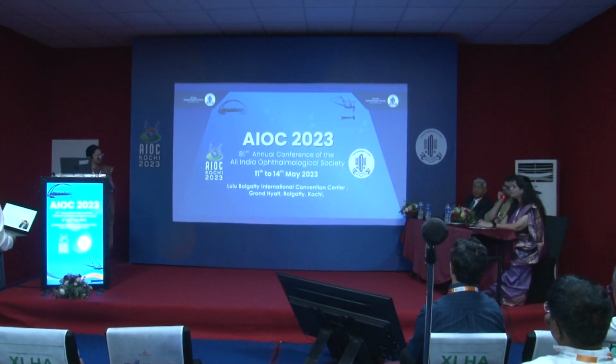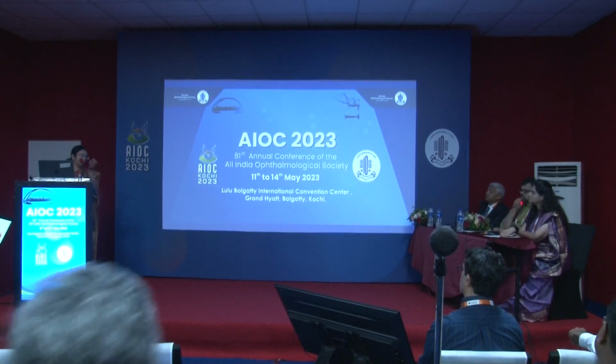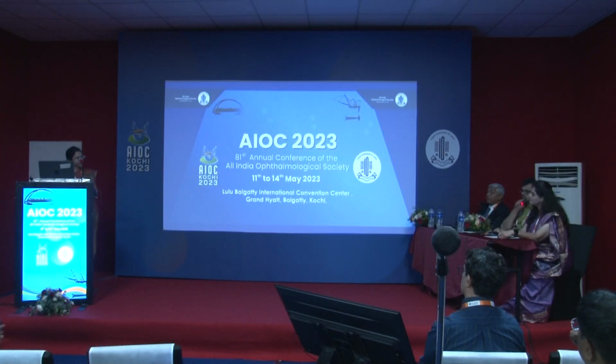And which formula do you routinely use in all your general cases? I always use the Barrett suite. That is the Barrett Universal 2, the Barrett toric calculator, and the Barrett TrueK for post-refractive eyes. All Barrett suite. Okay. So that also is available online? It's available online, on the ASCRS website, the APACRS website, and in the Lenstar, IOL Master, everywhere. Thank you.